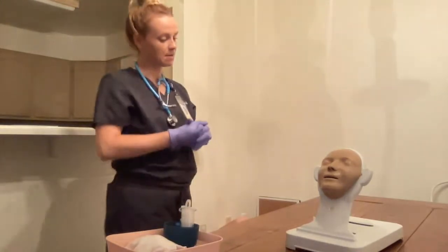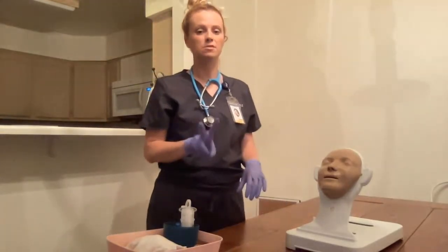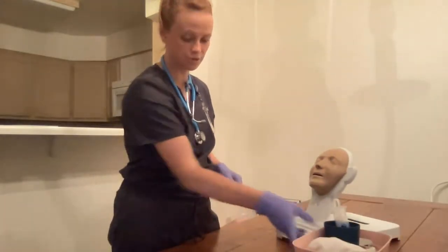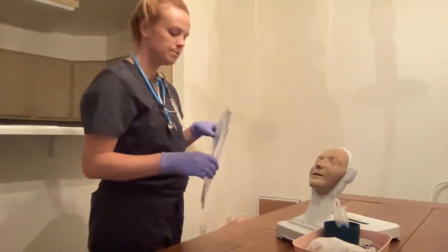Hi, Mrs. Smith. My name is Emily. Can I please have your name and date of birth? As I verify with her wristband, that will count as my second patient identifier. Alright, Mrs. Smith, my name is Emily. I'm here because your physician ordered you to have a nasogastric tube placed, an NG tube.